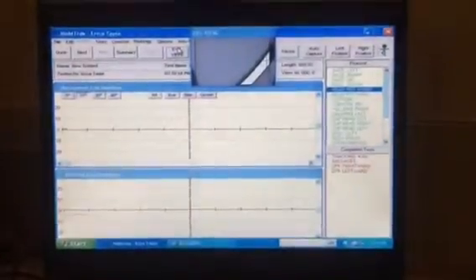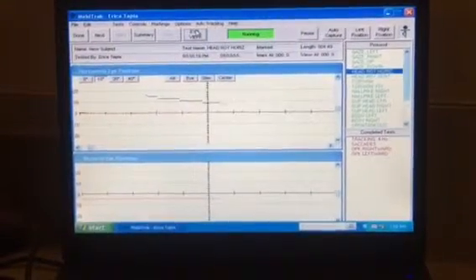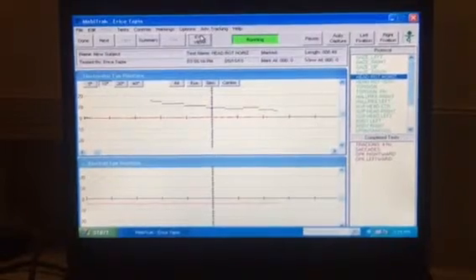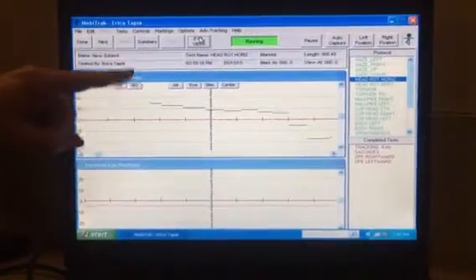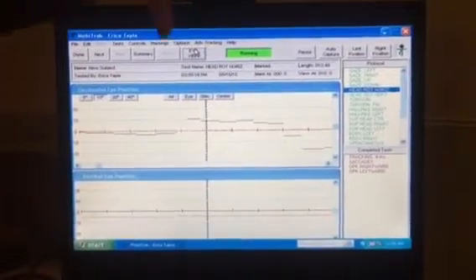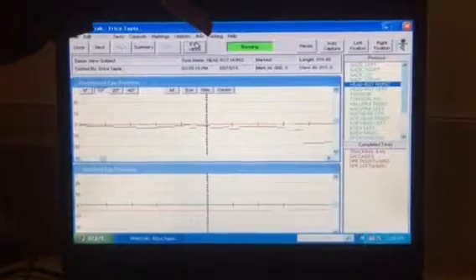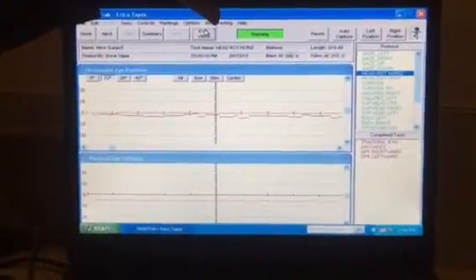Then everything stops because you're doing something different. You're doing the head rotation horizontally. And you have to see these two lines. You've got to see the DNA strands. Your patient has to be lined up with this. This may be a problem if your patient's down here. You may need to have them sit on a chair, on a pillow.